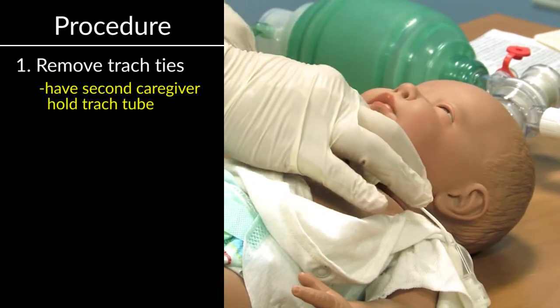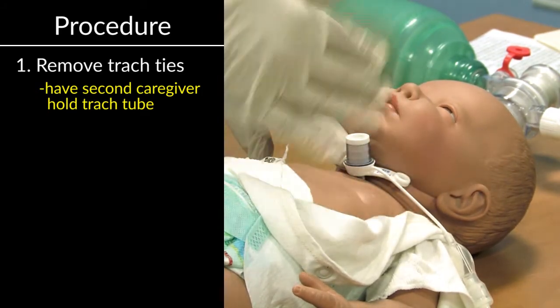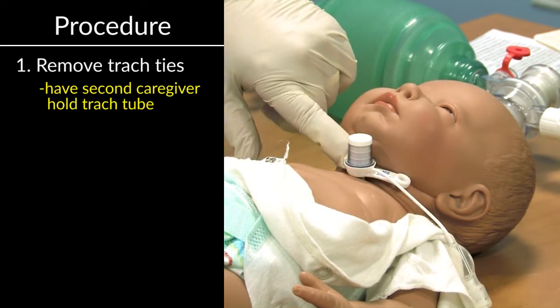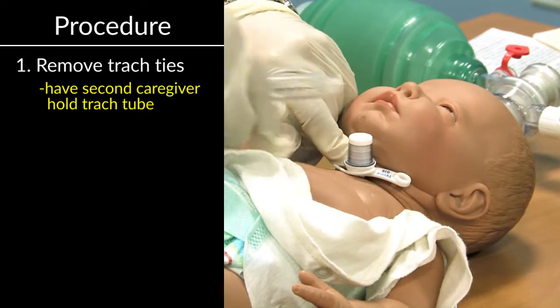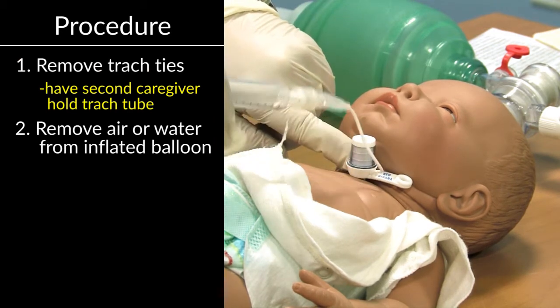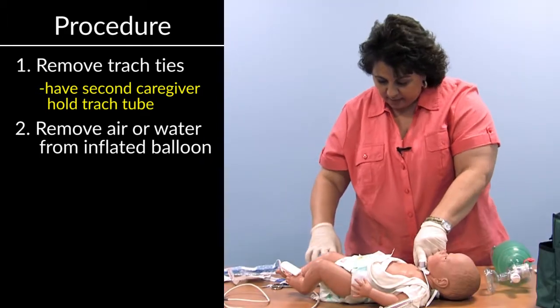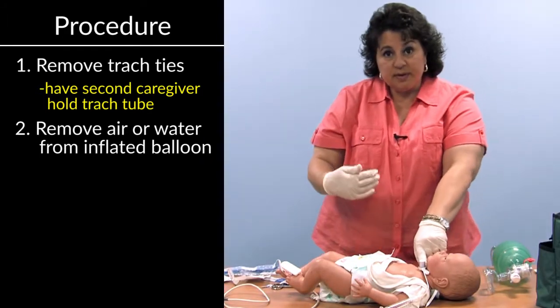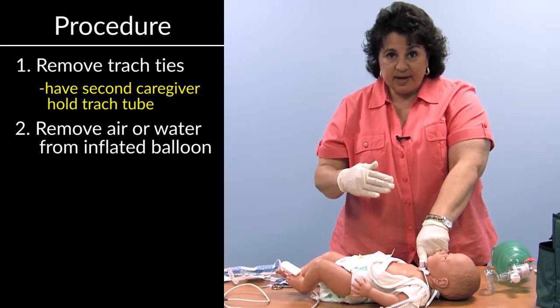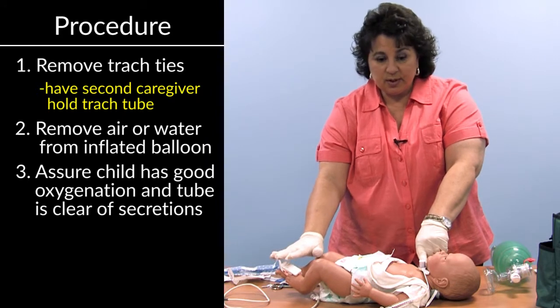My second caregiver is holding on to the tracheostomy tube and assuring that it's not going to be dislodged. We have a syringe to remove the water from the balloon if there is water in there, if it is inflated. And when the second person you're with that's going to insert the new tube tells you that they are ready, you're going to make sure that you have good oxygen saturation.